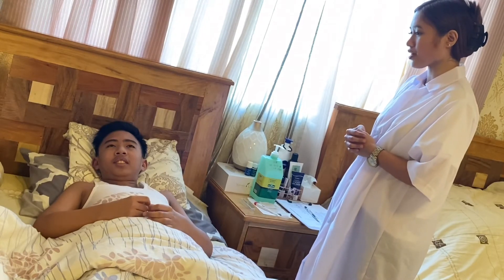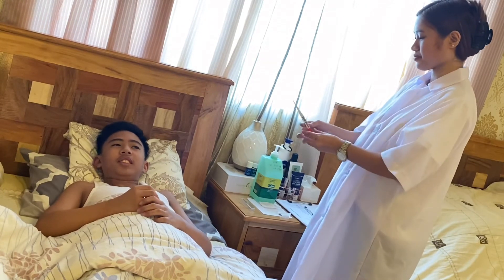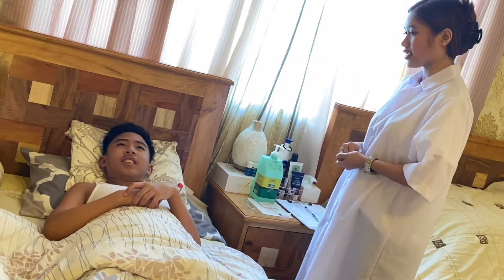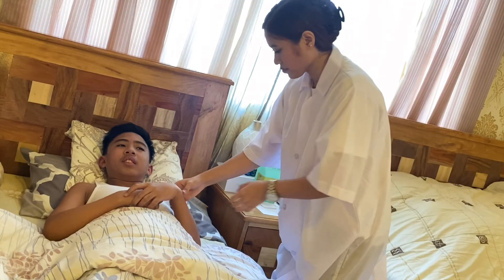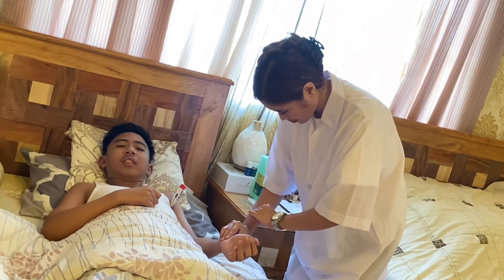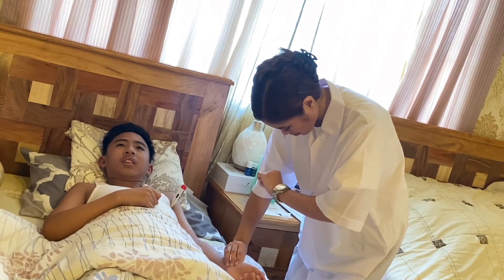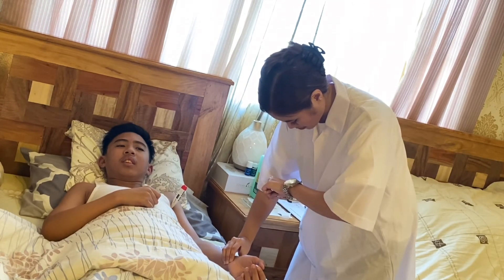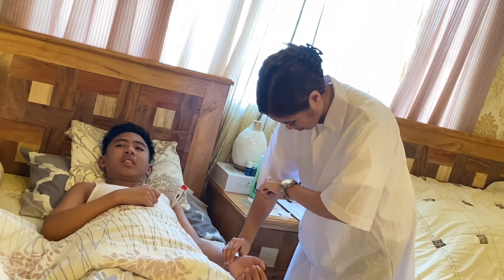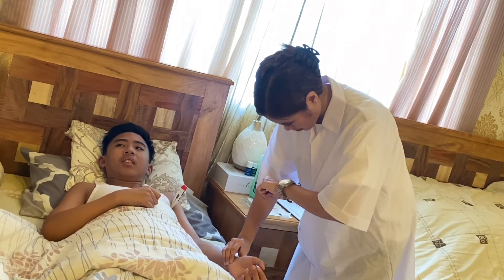Okay, Mr. Carmelo, for this procedure I will check your temperature using the thermometer. May I ask you to place the thermometer in your axilla? For temperature, wait the appropriate amount of time — the electronic and tympanic thermometer will indicate that the reading is complete through a light or tone, then read the temperature. For the pulse rate, palpate and count the pulse. Place two or three middle fingertips slightly and squarely over the pulse point. The index finger should be kept proximal to the heart and the ring finger distal from the heart. The proximal finger will check the force of the pulse; the distal finger obliterates the back flow coming from the ulnar artery. Light pressure is given by the ring finger to obliterate.